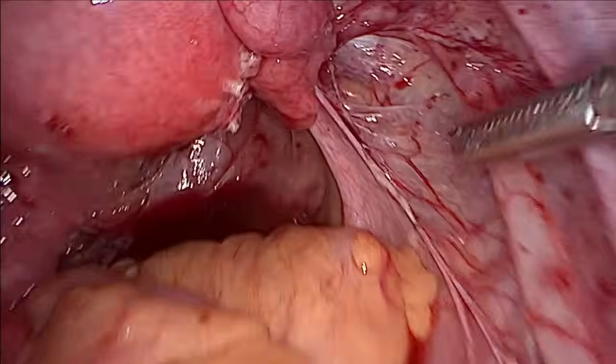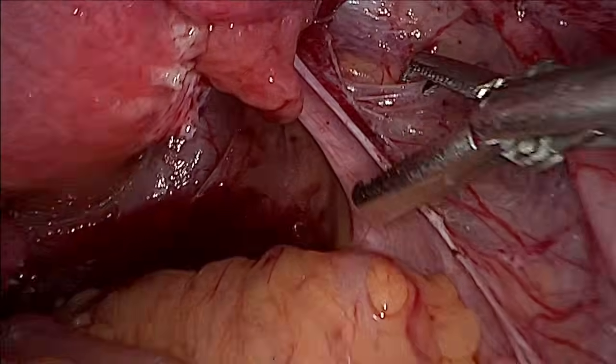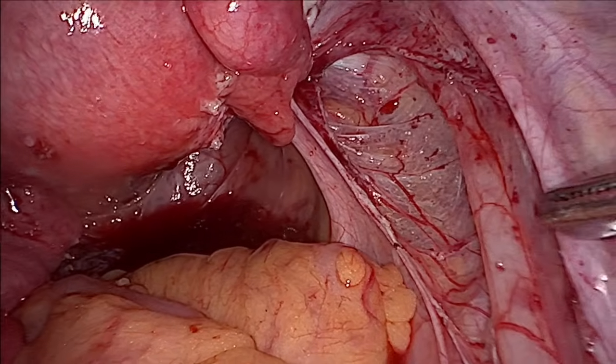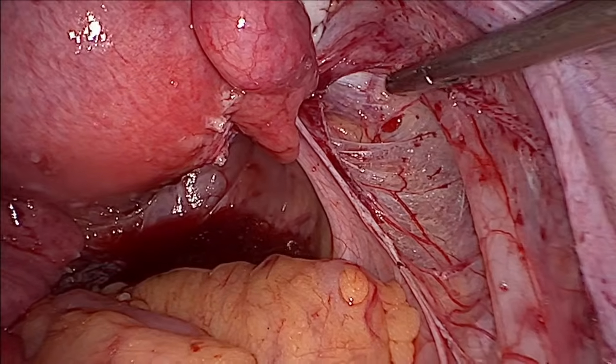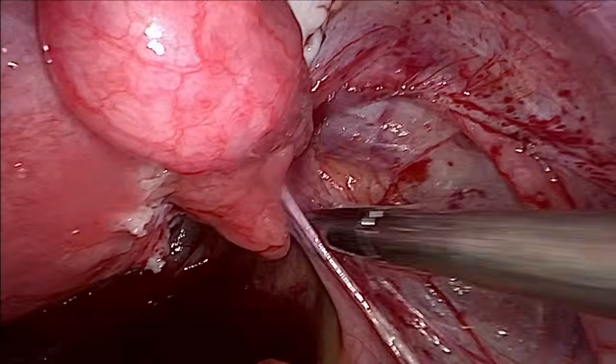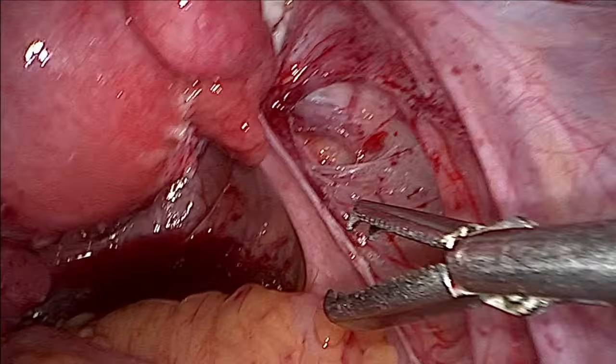So now I will lateralize the ureter here. Okay, the ureter has gone and it is lateralized. So now I can release this peritoneum. Okay, before, you seen, due to the peritoneum the ureter was going like this. So now because I have released the peritoneum, the pull is gone. Okay, and you can see the structures very nicely.